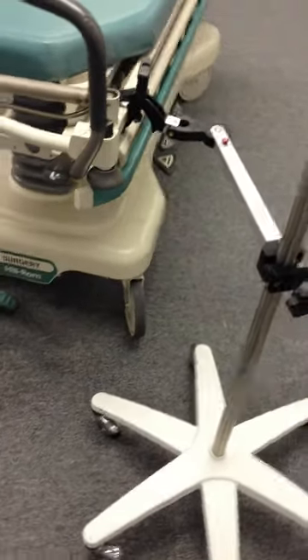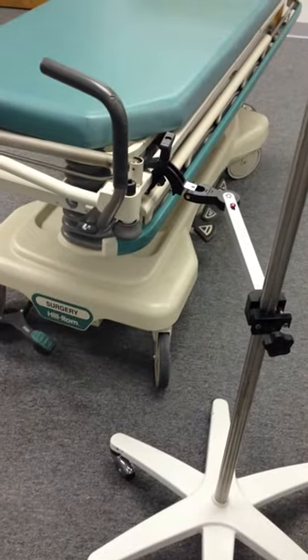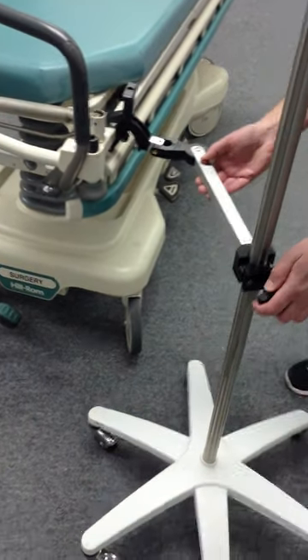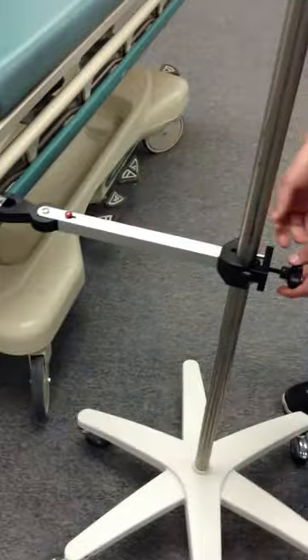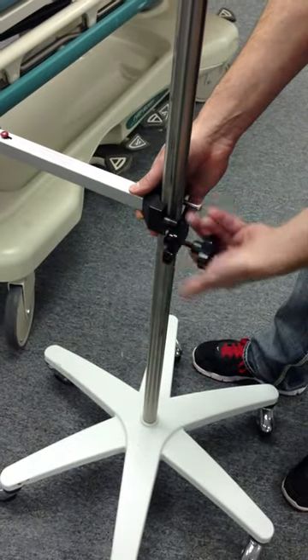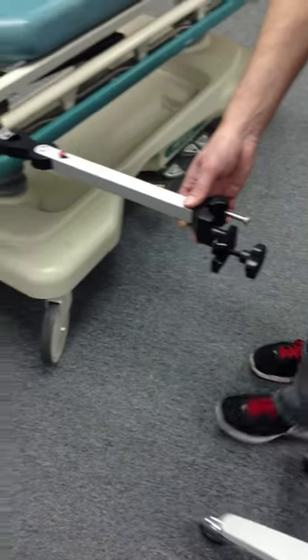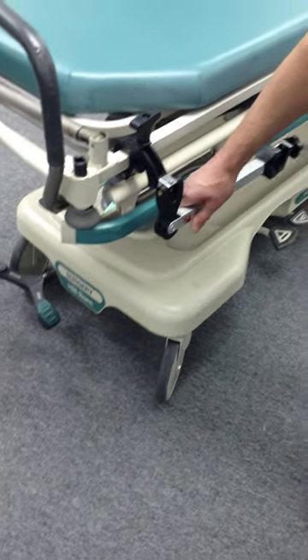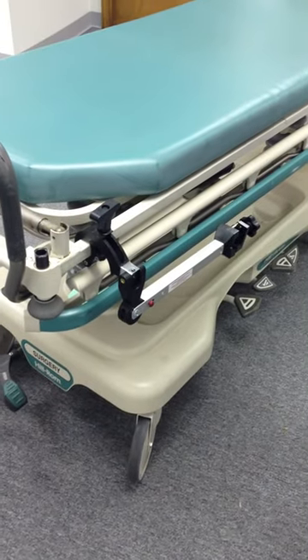And you can move the bed with the pole attached. And once again, when you're removing it, put it in line so it's straight with the clamp. Release that, and then this can either hang down here or you can put it at a 90 so it's out of the way.